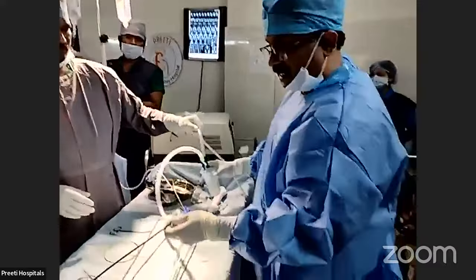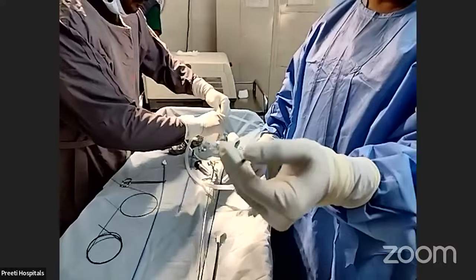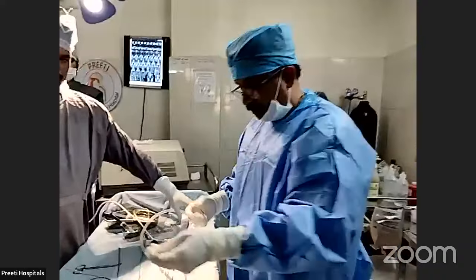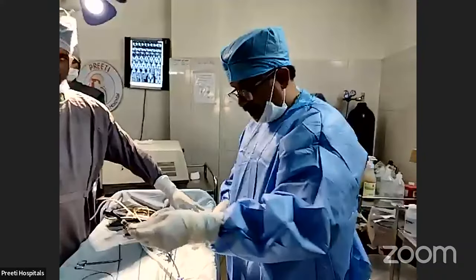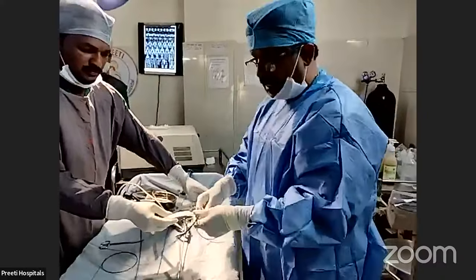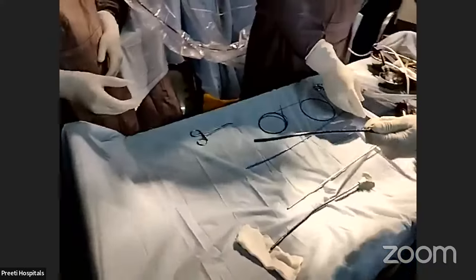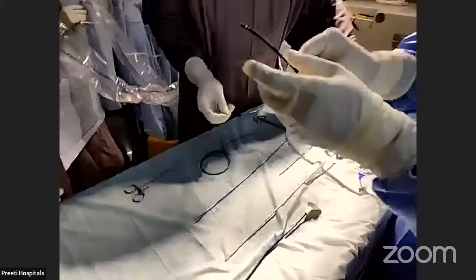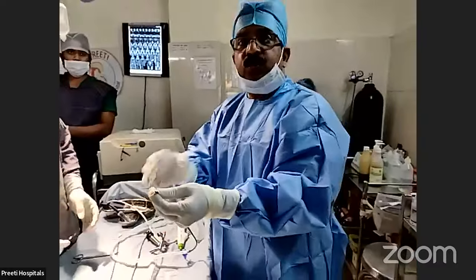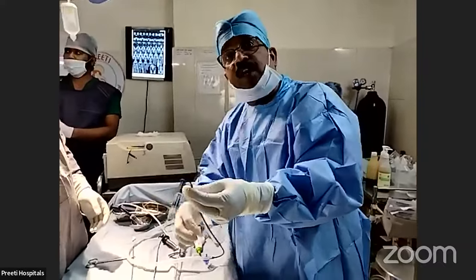So what happens is, if you leave it, this entire lumen is big. That lumen water will be sucked along with the powder. When you insert a scope, which is only 7.5 or 7.3 as a matter of fact, you see here, a lot of gap will be there. That gap will take all the powder. So if you want, you do powder only, but slightly bigger powder will also come.